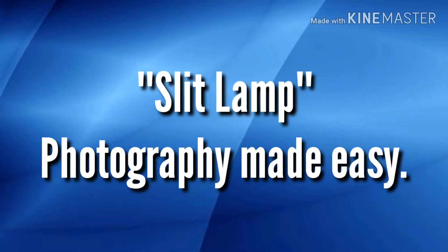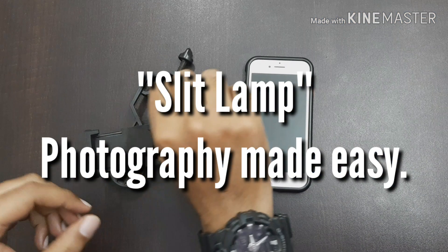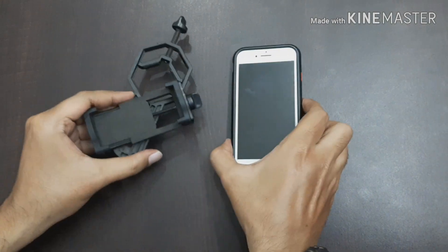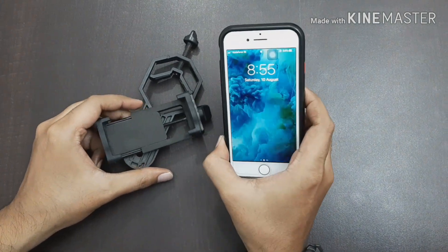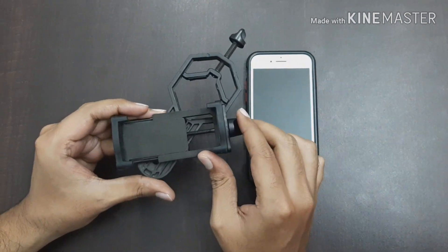Hello everyone. Today we'll be discussing how slit lamp photography can be made really easy. All you need is a smartphone and an adapter. This adapter is available at a very cheap price on Amazon, and you don't need any fancy expensive equipment to take slit lamp photographs.